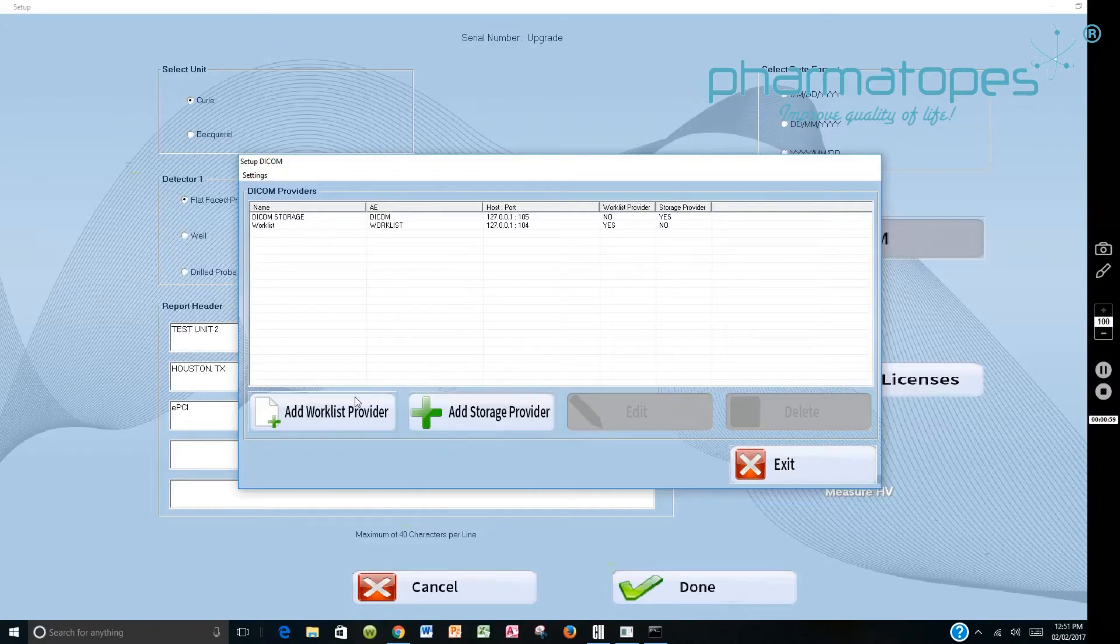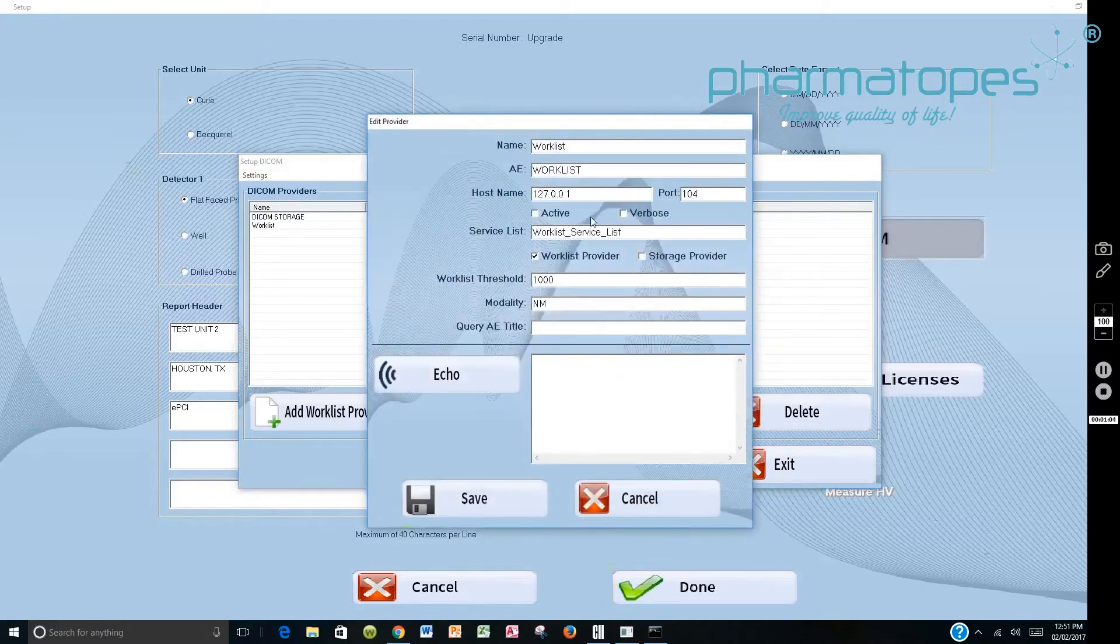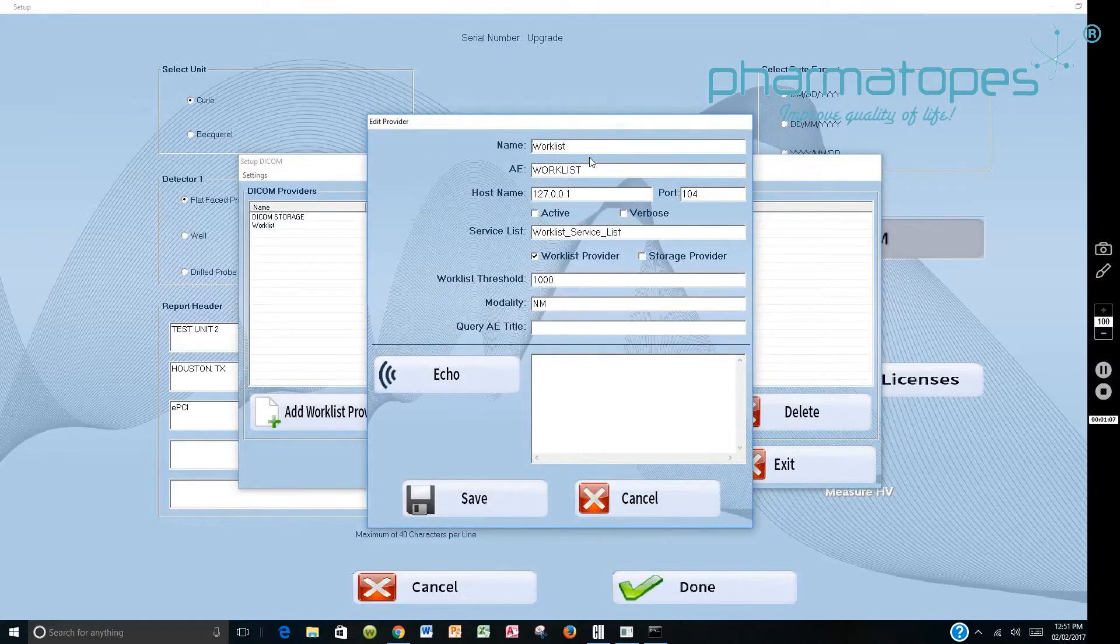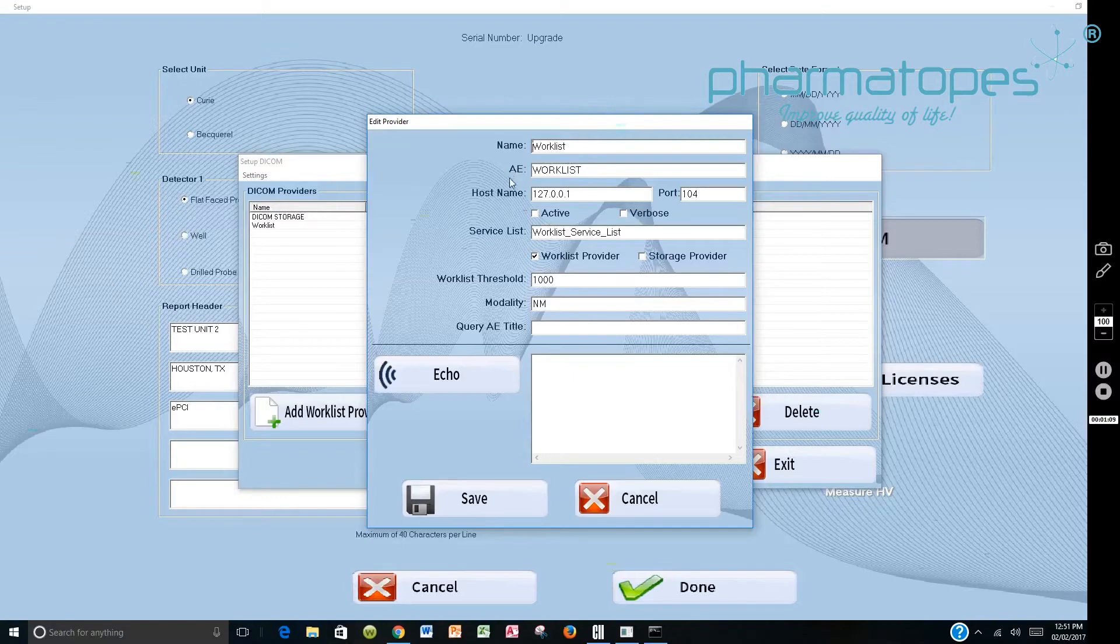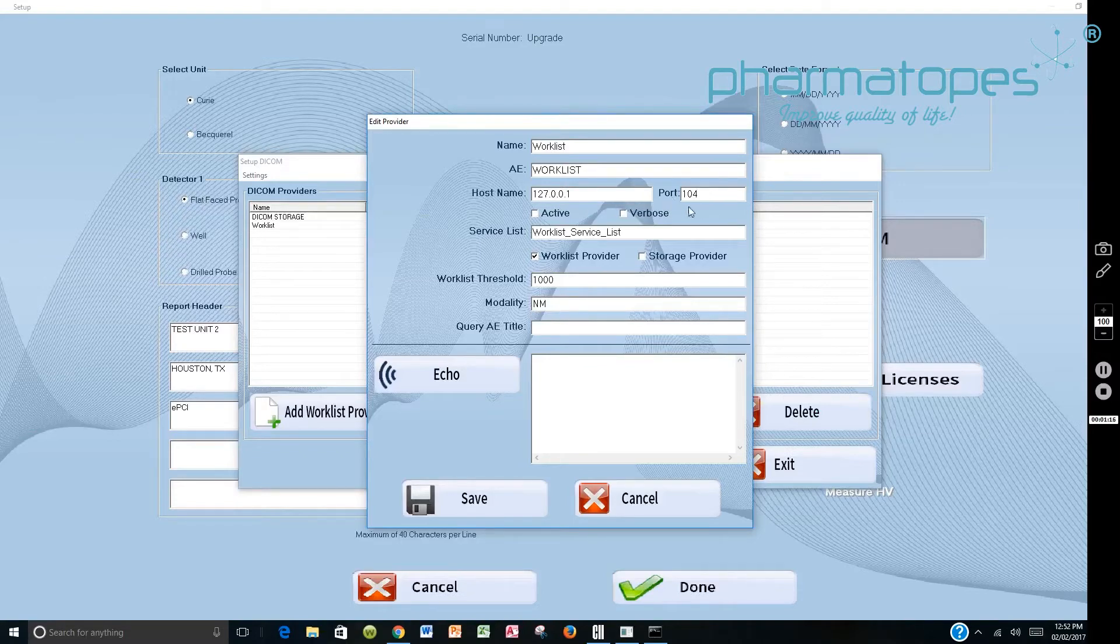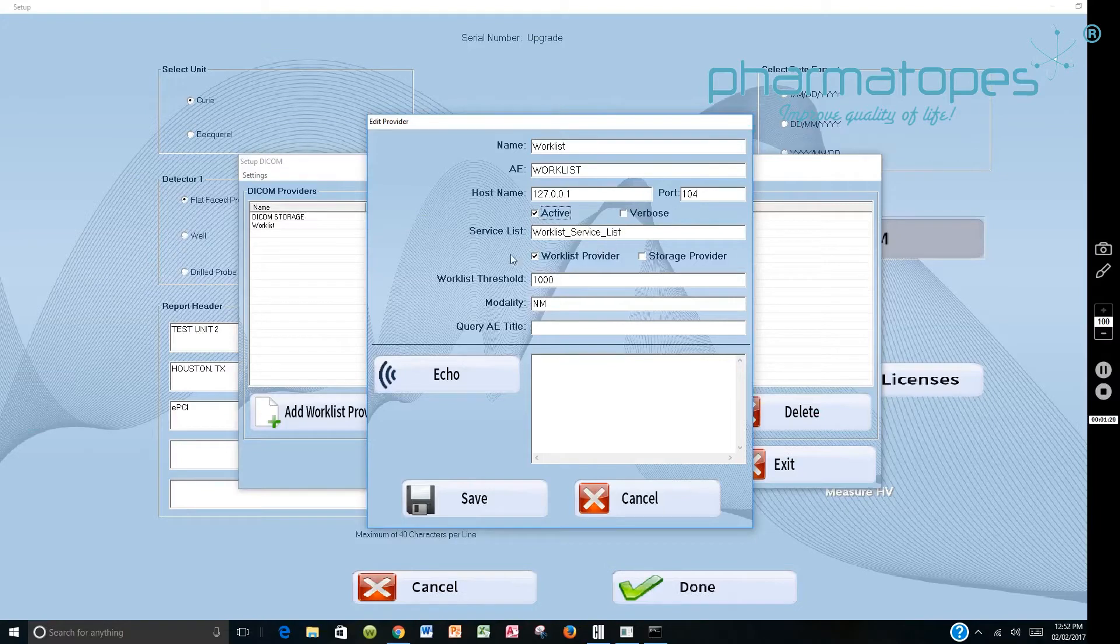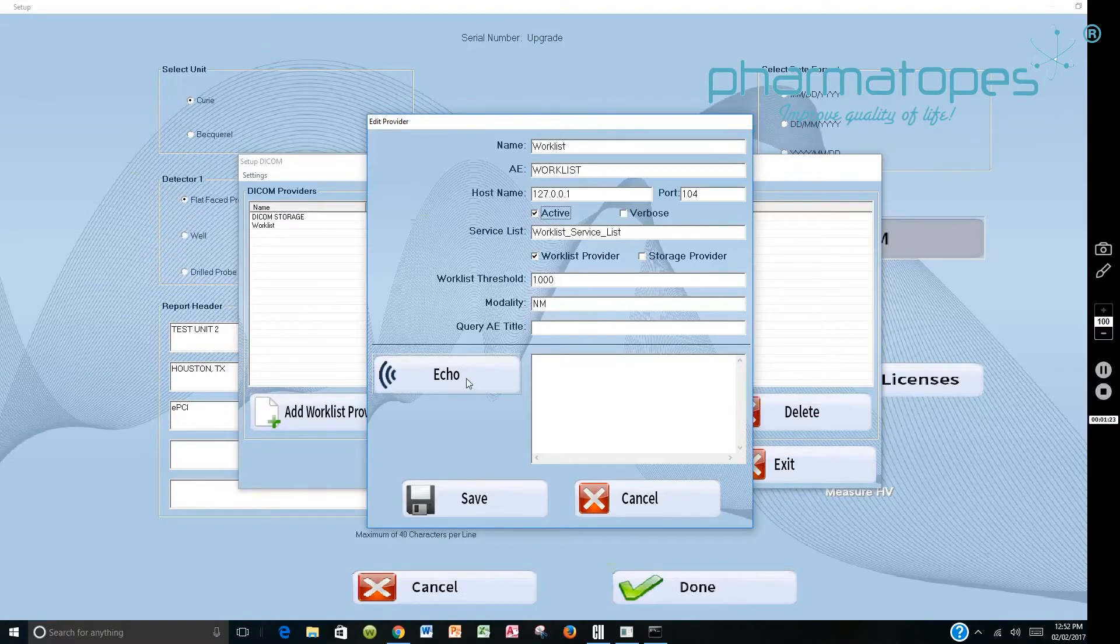Then you want to add the worklist provider, so you click on that. I've already done that, but we'll edit here. It'll come up and say Name. In my case I call it Worklist. Then the AE title is provided by the PACS Administrator, the host name which will be the IP address and the port that it's found on. Then I usually select Active. This part here will be automatically filled in, so you want to Echo.